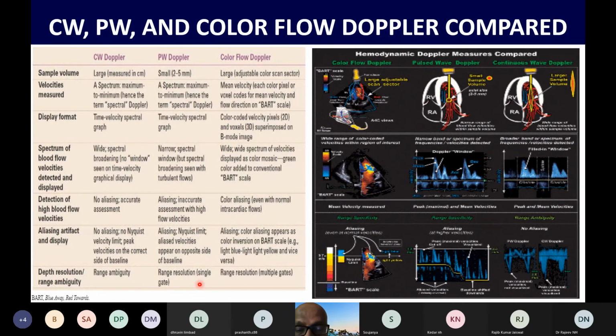And the color flow Doppler, especially when you're talking about mitral regurgitation, is influenced by the technical factors as well as the hemodynamic factors. That is, if you're mapping the color flow Doppler area during anesthesia, the color flow signals will be much less as compared to the awake conditions. So we have to take into account all the factors which are responsible for a correct assessment of a given regurgitant jet area.